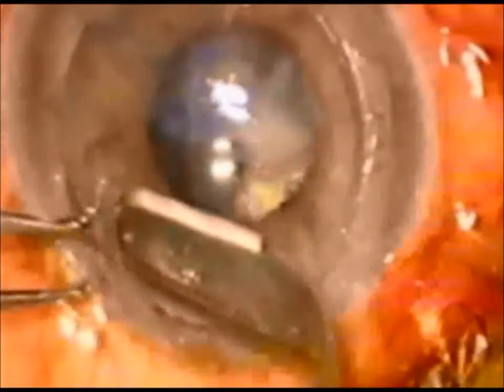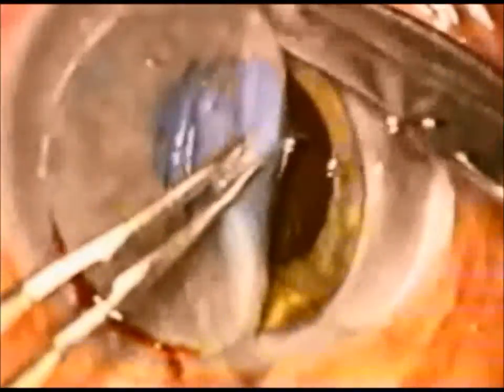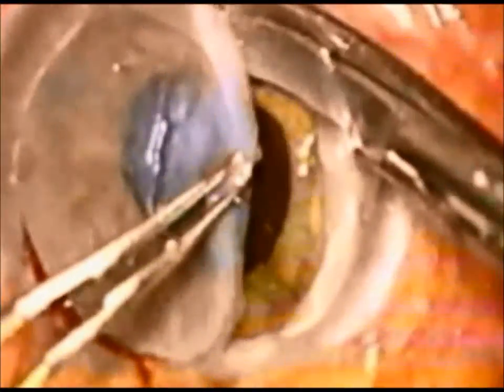The lamellar pocket is created up to the limbus all around with a crescent blade. The anterior chamber is then entered and the host is cut full thickness and removed.